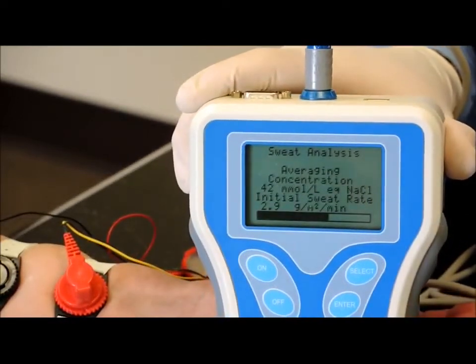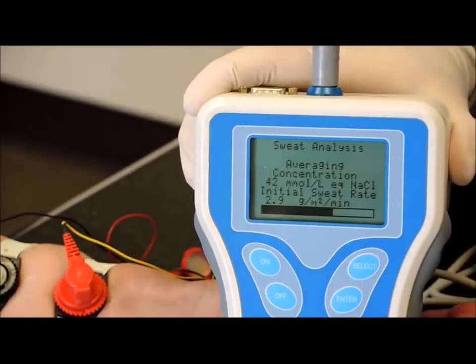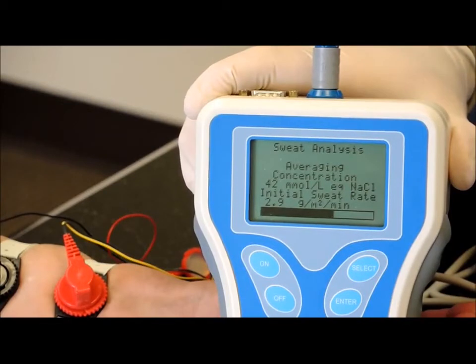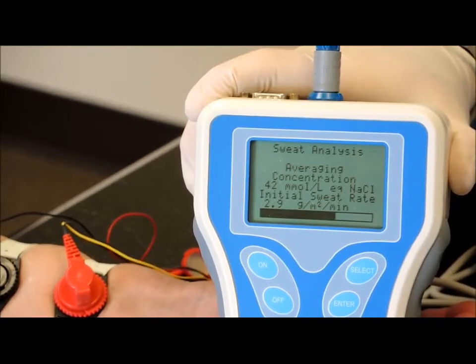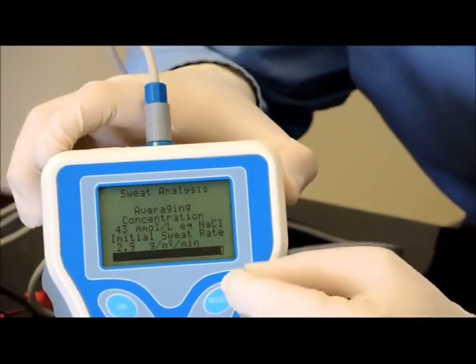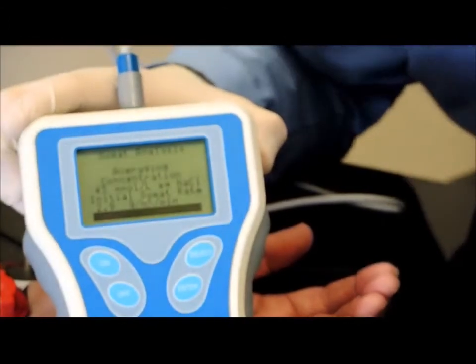So we're a little bit past halfway in the sweat test. You can see by the progress bar we're past halfway. Her reading is now 42 and holding steady at 42. Again, that's very normal. And we'll just see at the end what the final average value comes out to be. And the sweat test is progressing. Now you'll see that the sweat test is almost complete. The progress bar just has a little bit to go.